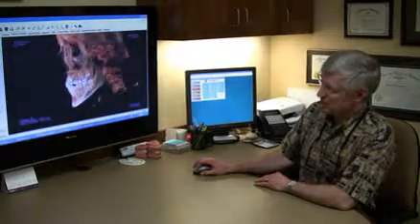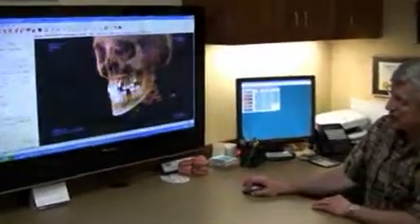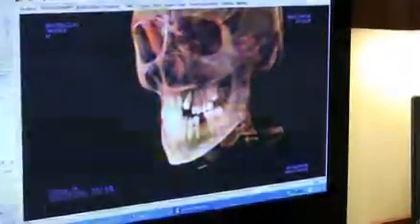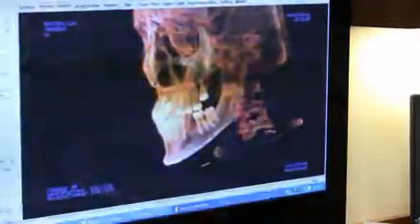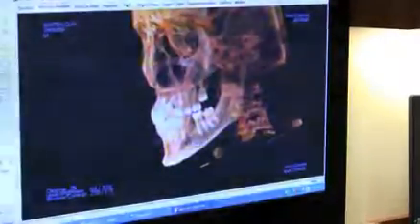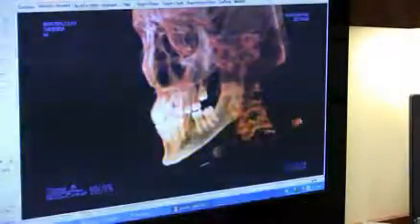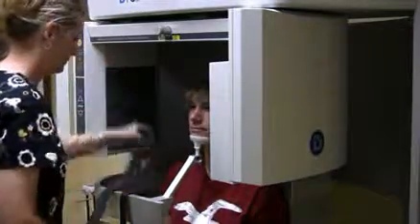An example would be something similar to this tooth right here, but a tooth that is sitting right behind this adjacent tooth. And what we sometimes see is that there's already been some damage to the root of the tooth by the unerupted tooth, and to know that before we start is very important for us so that we can appropriately move the teeth to minimize any additional damage.